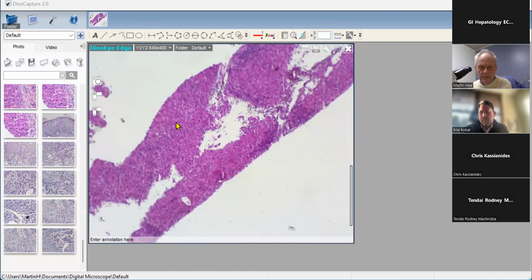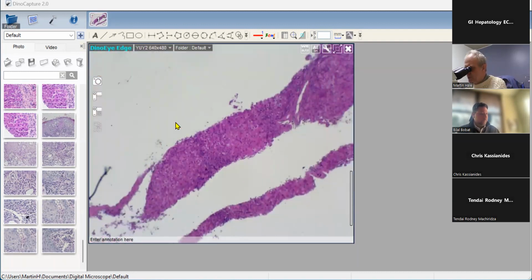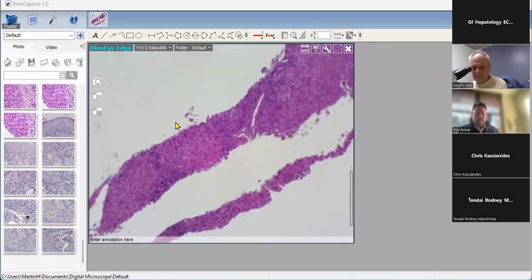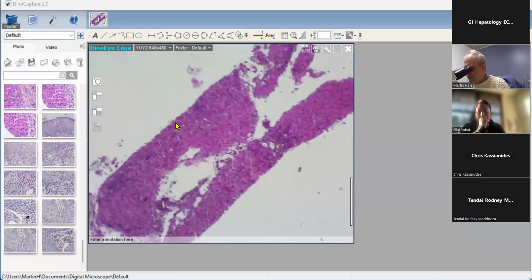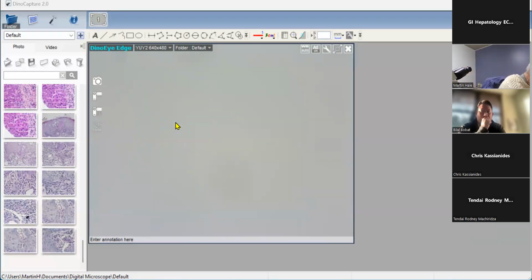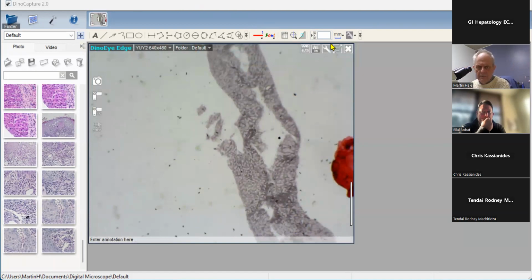We did not actually see in our department the original biopsy. But I think if we look at this biopsy, as I said, unfortunately it is a little bit fragmented, which is procedure related. But nevertheless, I think one can appreciate that we can probably have a fairly good interpretation of the changes. So this is what it looks like. I'll show you the H&E first. Just run down it, and then if we look at the reticulin stain of that particular core, we can see that there is certainly some disorder, and we'll go into this in more detail. I'll just make this field a bit bigger.